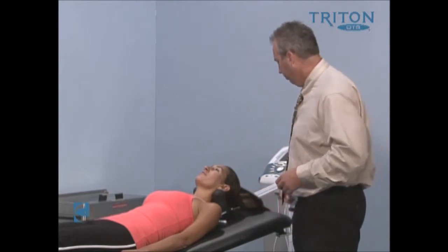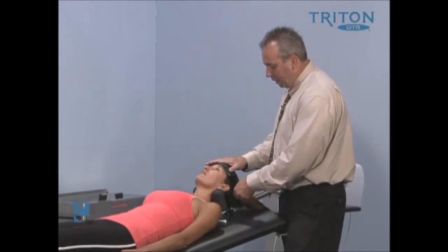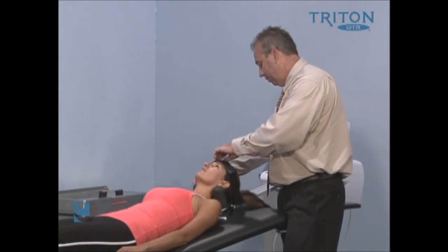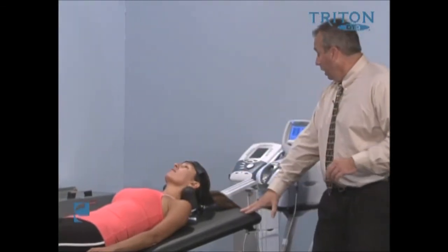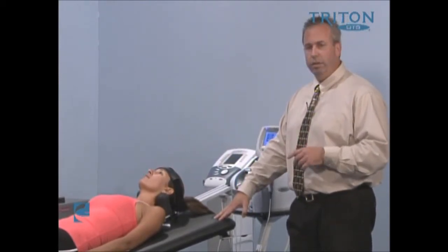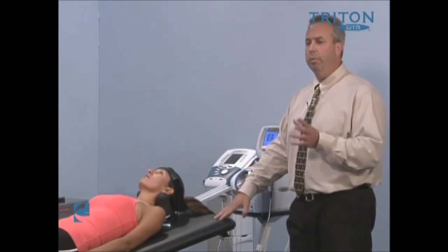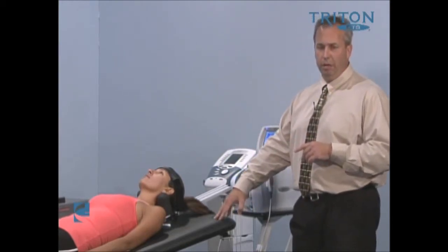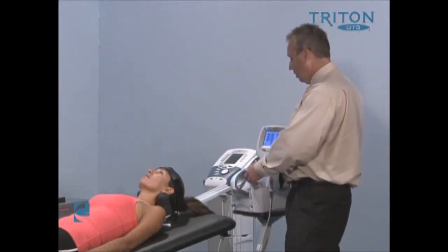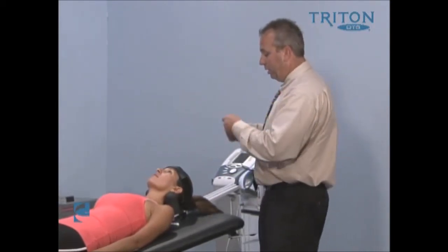Patient comfort is important, so we're always asking patients how they feel when they are strapped into the device. The clinical protocol determinations are very similar to that of lumbar traction. We keystroke in, we can save protocols, we can retrieve protocols in the same manner that we did with the lumbar traction. The difference when we attach the device for traction in the cervical spine is that we're actually going to attach it to the device itself.